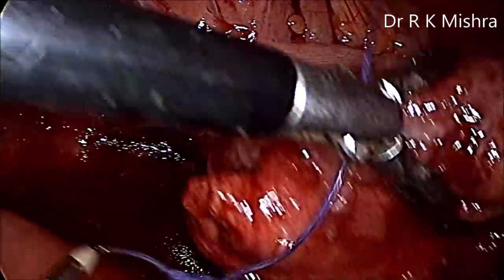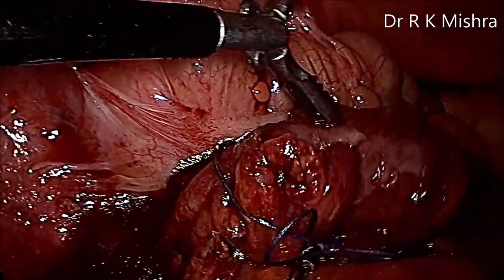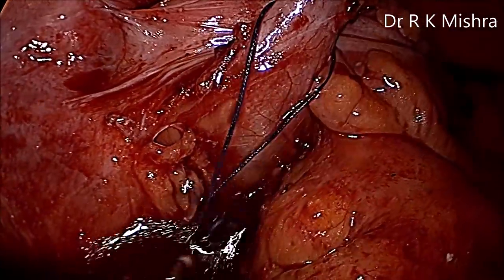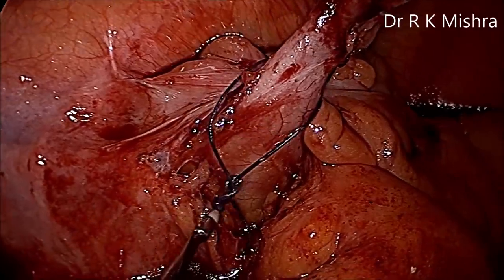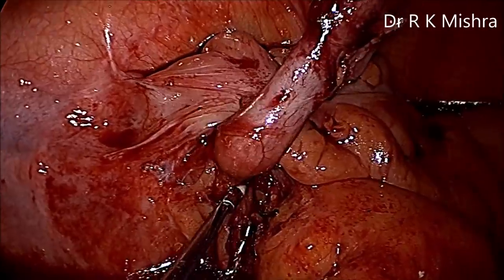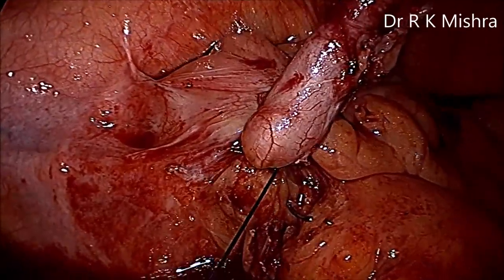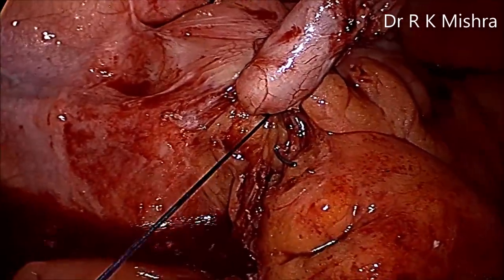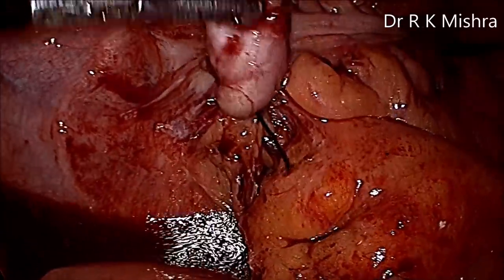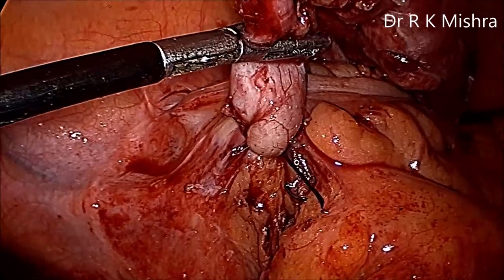The tip of the knot pusher should be brought to the base, and virtually you should try to ligate the base near the cecum, and automatically it will go to the junction. So it is going, and you just pull with a little traction down and ligate it, so a nice dumbbell is formed. And this one knot is more than sufficient, and you can apply it very nicely and then cut with the scissors. After that, you can cut the remaining appendix with the harmonic.